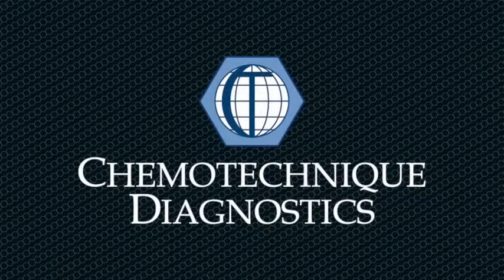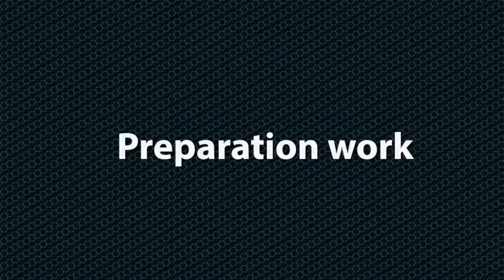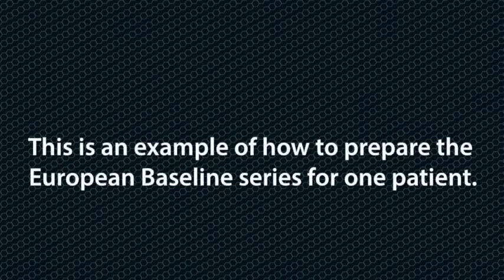Welcome to Chemotechnique Diagnostics. We hope that this instruction video will facilitate and make your patch testing more efficient. This is an example of how to prepare the European baseline series for one patient.